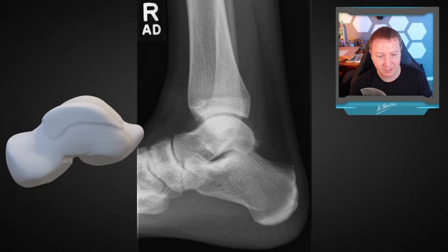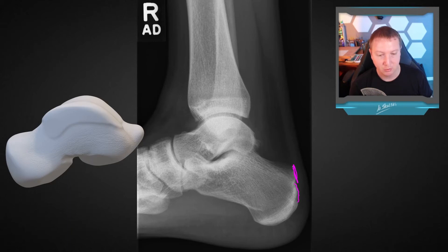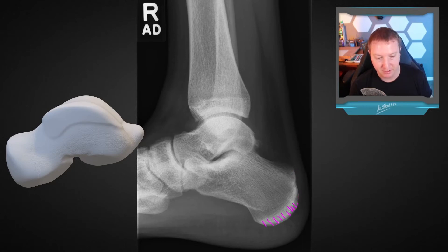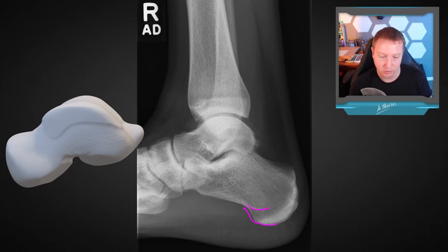Coming down past the first smooth facet — where our retrocalcaneal bursa lives — is our Achilles, which comes down to its attachment site on the middle facet of the calcaneal tuberosity. That's a slightly rougher region next to the smooth region where it glides past with that retrocalcaneal bursa. Then this is the weight-bearing portion, the big thick chunky part of the calcaneal tuberosity — the weight-bearing facet — which transitions smoothly into the medial tubercle, and the smaller lateral tubercle often projects as a little cortical line.